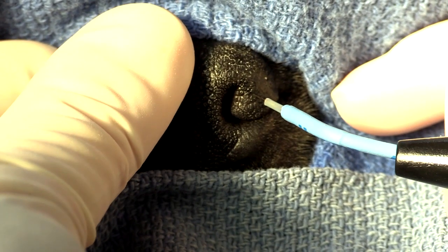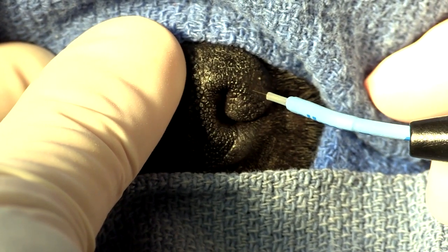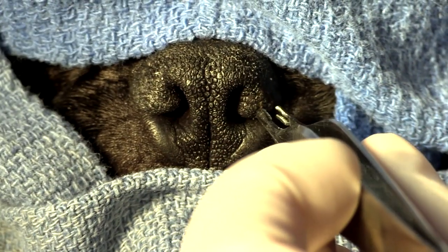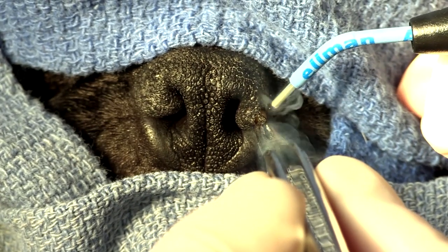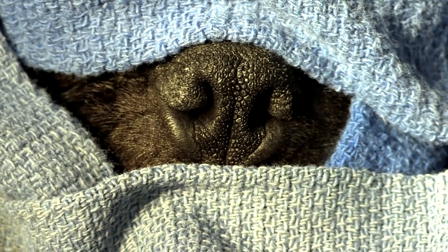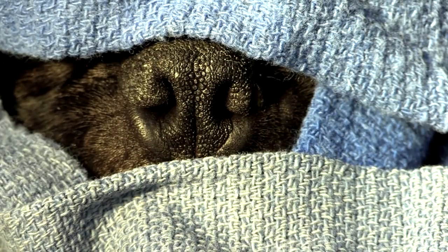I'm just going to come in and make a little triangle, and the triangle depends on how much you want to open that up, because you can see if I pull that over, that's kind of where we want to be. There's my first incision. The Elman is beautiful for this because it just cuts that so cleanly and beautifully. I can get a nice wedge — just look how bloodless that is. You can see there's my wedge, and look how beautiful that is — there's no bleeding. The nose is such a vascular area that it's just nice not to have to deal with that.